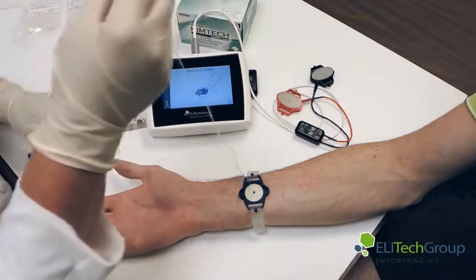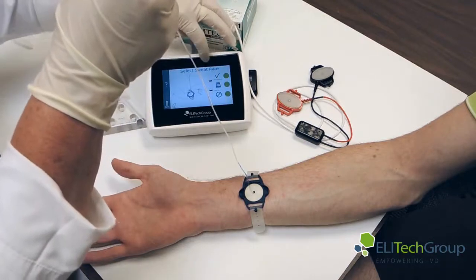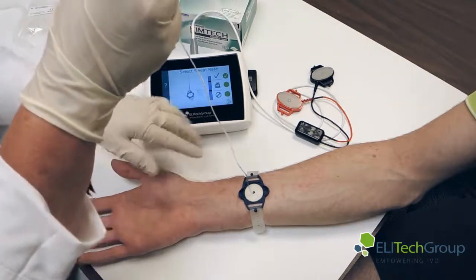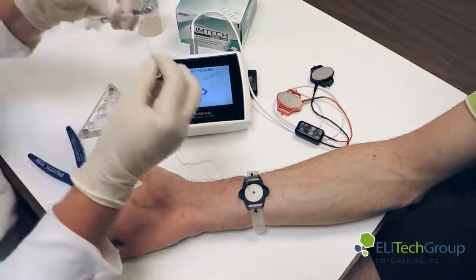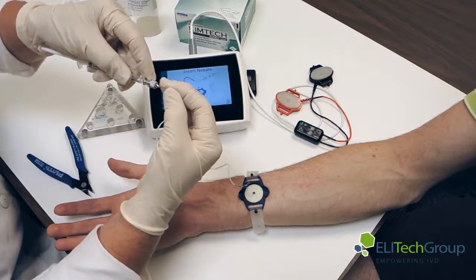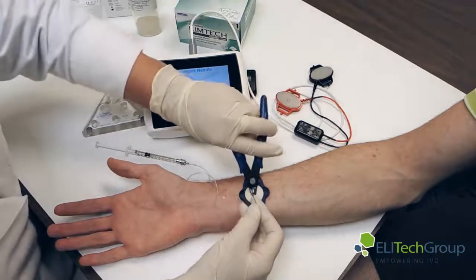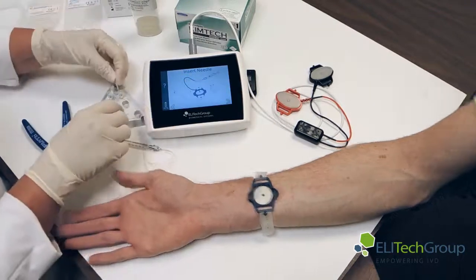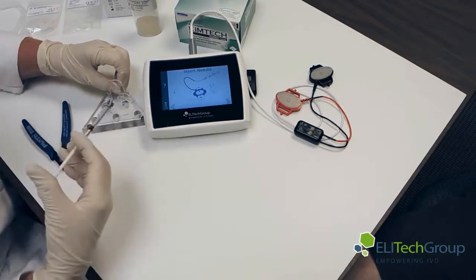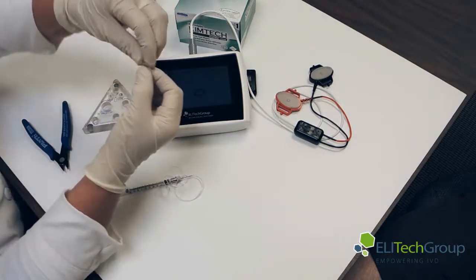The next step is to pull it up. You can see I've grabbed it between the two marks. Now we've got the sweat collected. We mark it that the sweat test is valid. Now we have the syringe — make sure the syringe is open. We add the micro-bore tubing to it. Then we collect the sweat by nipping. We move to our collection device and push the sweat into our collection tube using the syringe. You can see we have it in the bottom of the tube. Close the collection tube.